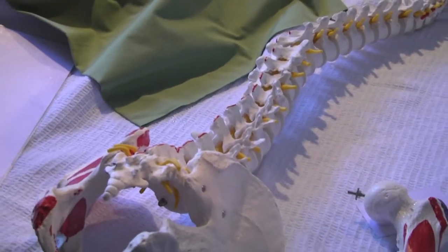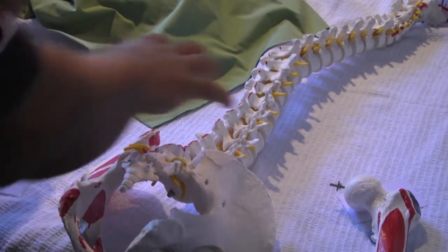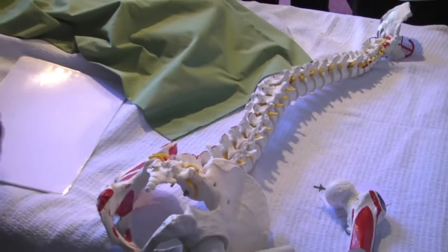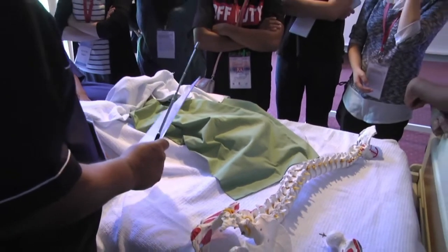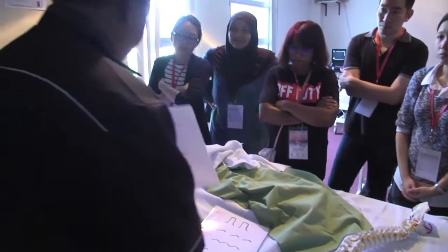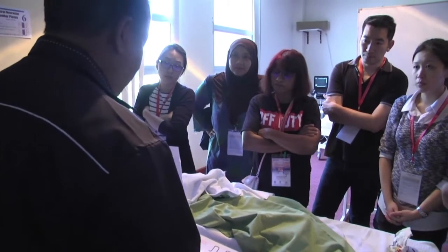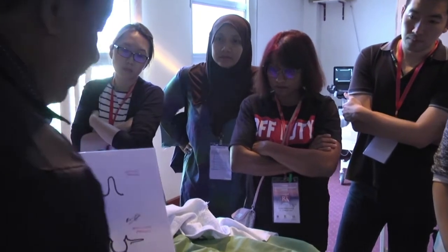Secondly, how do we recognize these? It's quite difficult because they're often wrapped around by a lot of muscles. So we developed something called a water phantom, which you can read about, and you can learn it once and teach it thereafter. I cooked something up for you because I don't have a water phantom. When you scan the phantom through water, these osseous elements create a very specific type of sonographic appearance.